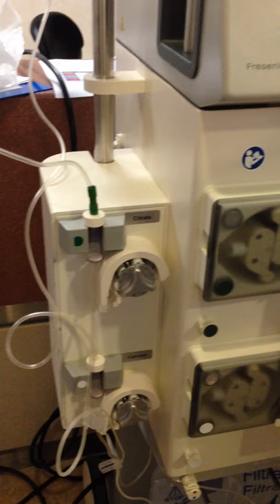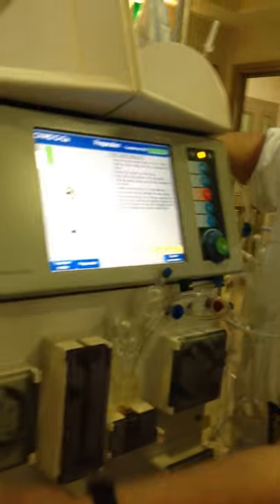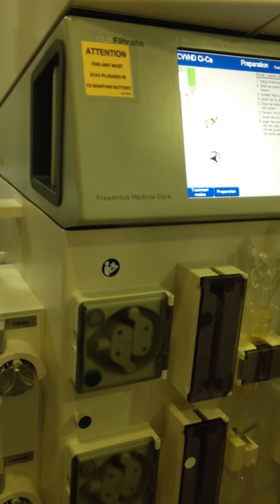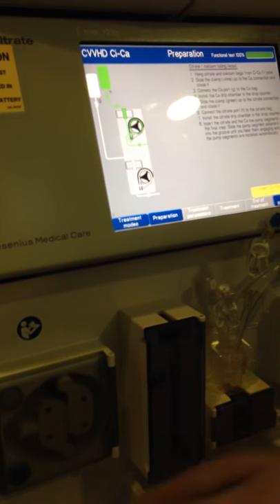Because it's already full. The reason why it has to be empty is that when you slide the pump segment, it will create a negative pressure. That negative pressure, once the priming starts, will pull fluids exactly the right amount just to fill this chamber. You understand that? Is that clear? Any question? Next, insert the citrate in the calcium line pump segment as the final step.